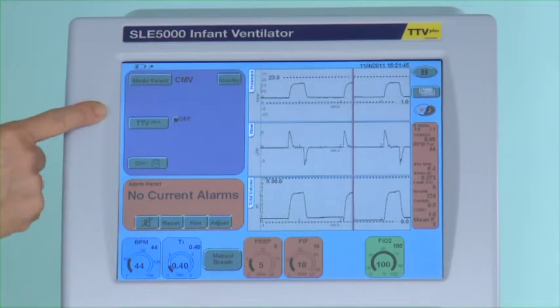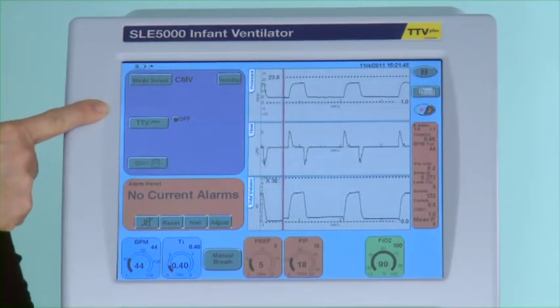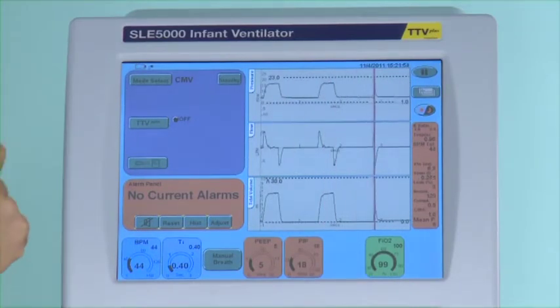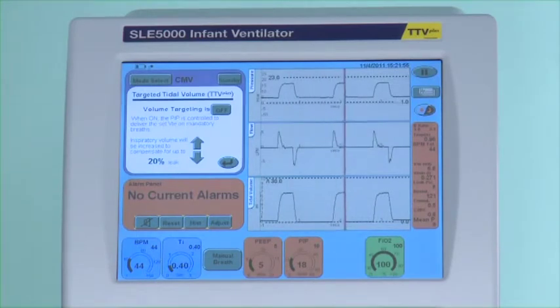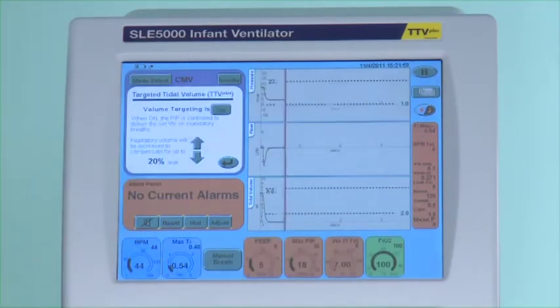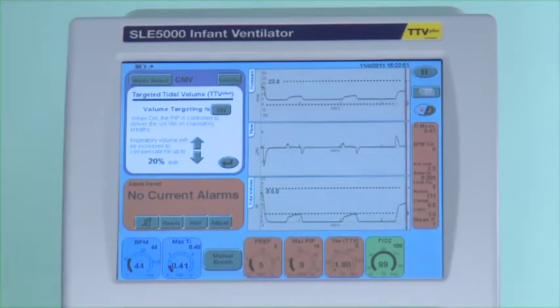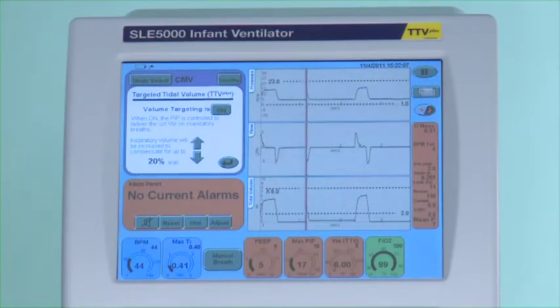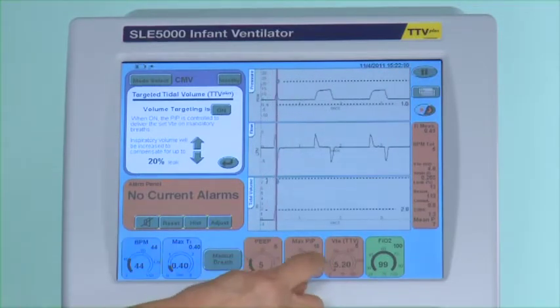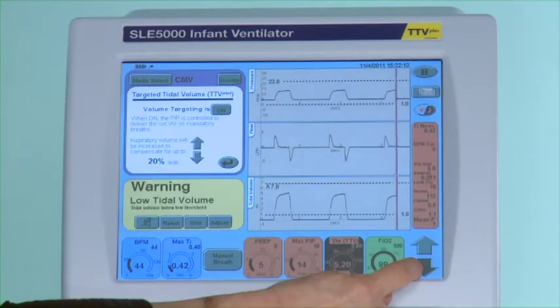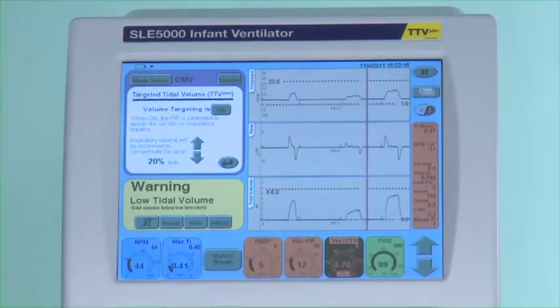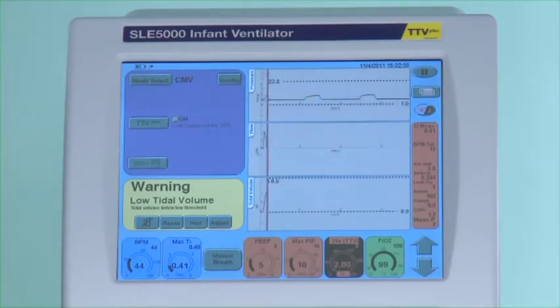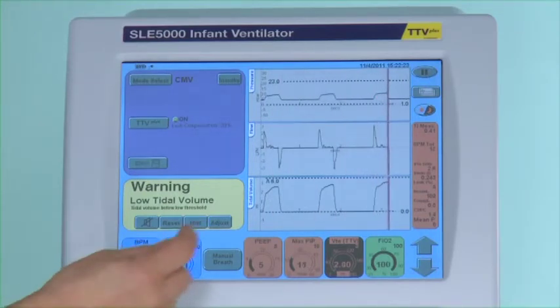However there is a way of automating this process and we call this targeted tidal volume or TTV. By selecting TTV plus and switching it on you get another window along the bottom where you can choose a volume that is appropriate for the patient you are ventilating. The default setting is 3mL of volume. One has to be a little mindful of selecting less than this as you will be ventilating the dead space and not introducing much fresh gas.